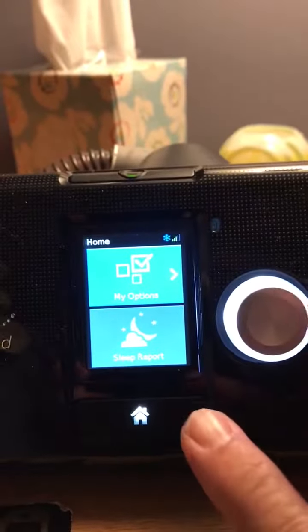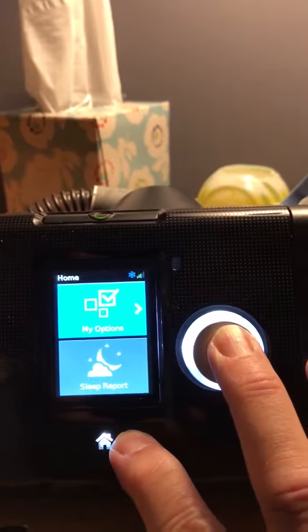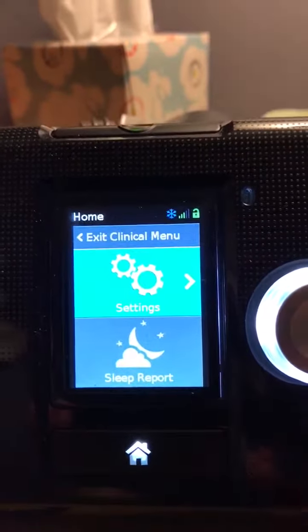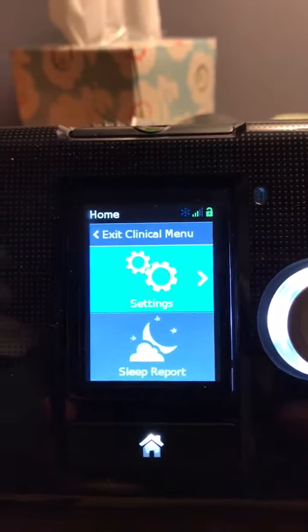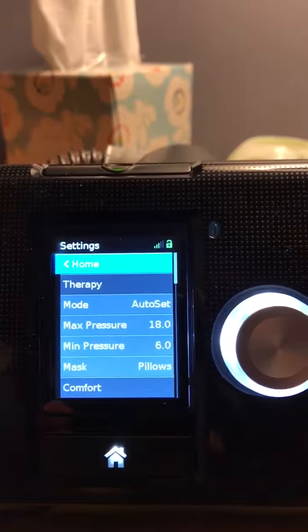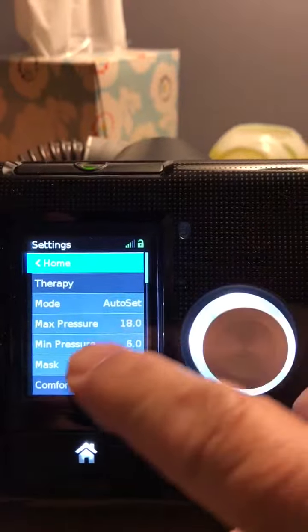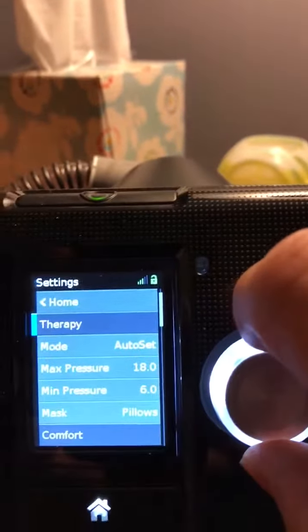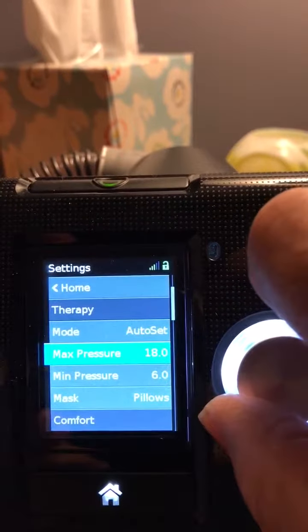What you do is press the home and the dial button for 5 seconds. You'll see it changes to settings. You hit settings and this is how it was set, probably at the oxygen place where you got it. Mine was at 5.